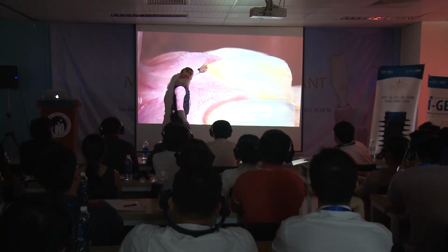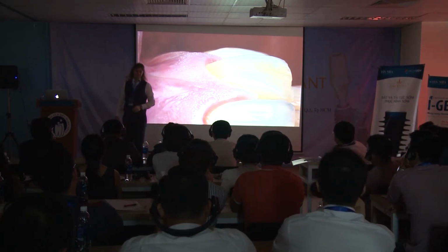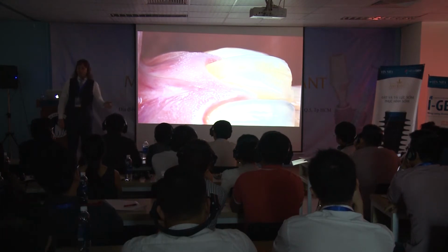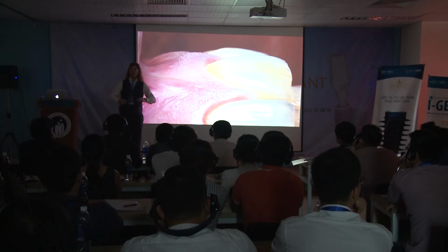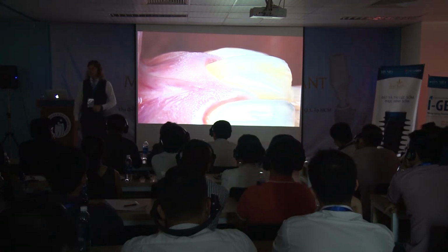Because I was trying to keep this, but I didn't notice that this is a very thick biotype. So a socket preservation and implant positioning will be more than enough. I wanted to do more, and this was my mistake.